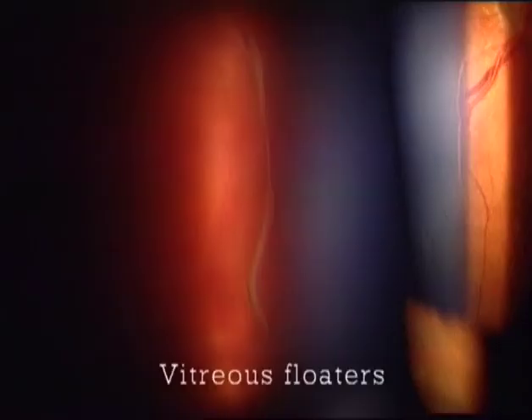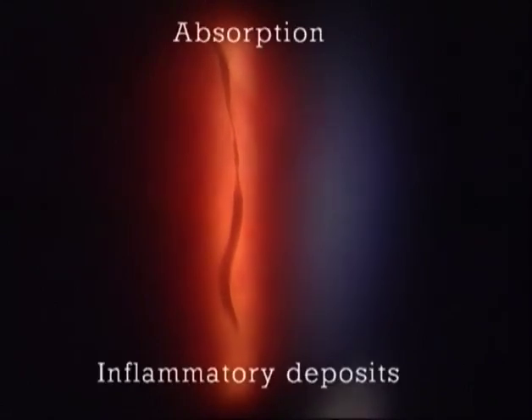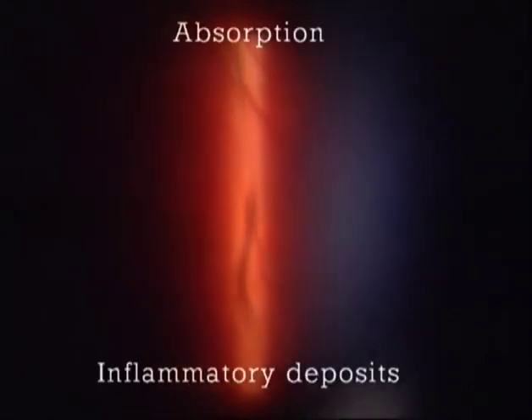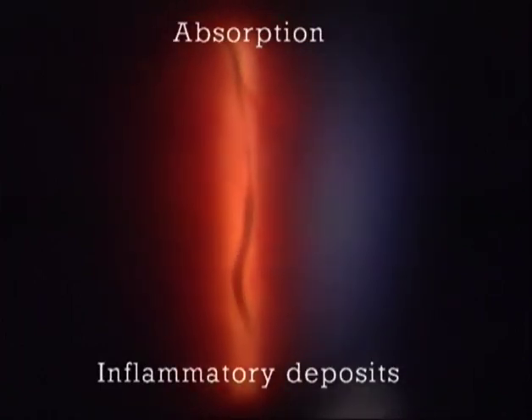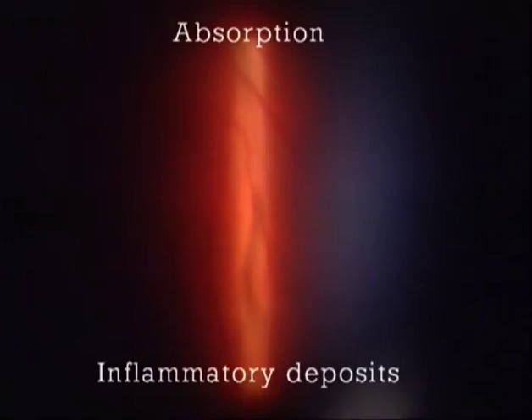Here are two examples of vitreous floaters which look similar in direct light, but one is clinically significant and the other is not. The absorbing floater always appears black, as here, by the inflammatory deposit on the posterior vitreous surface in case of an inflammation of retinal vessels. And when the absorbing object moves and is slightly out of focus, the center will always remain black, and only the margins will be blurred.